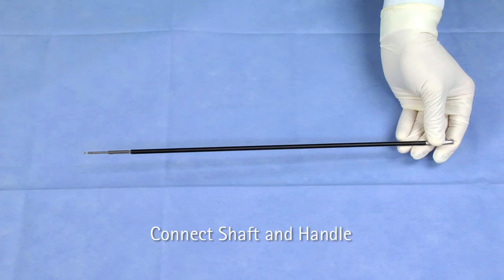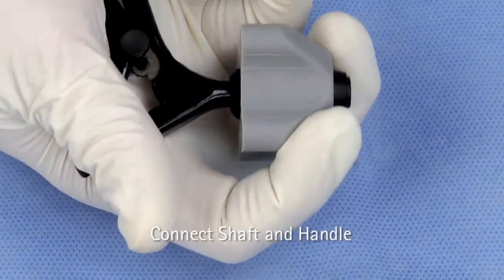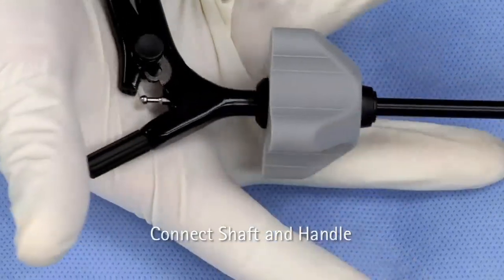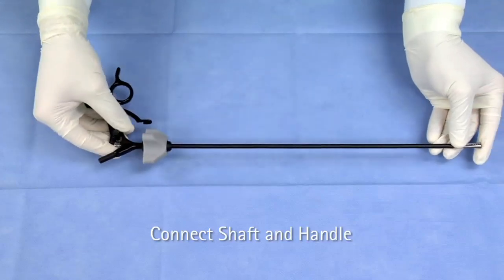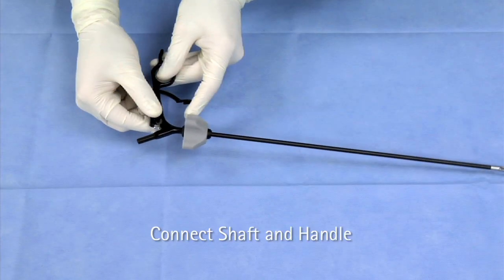Hold the shaft firmly by its tip and pull back the handle rotation knob with fingers and maintain hold. Fully insert the shaft and release the rotation knob. Connect the handle with the jaw insert ball joint by depressing the black handle buttons on both sides of the handle.